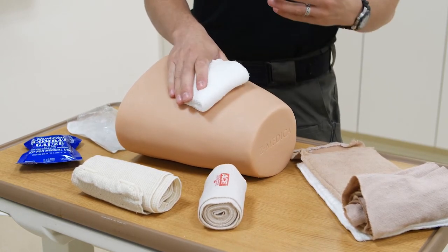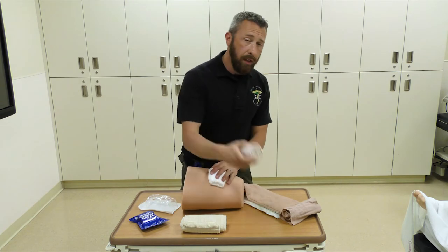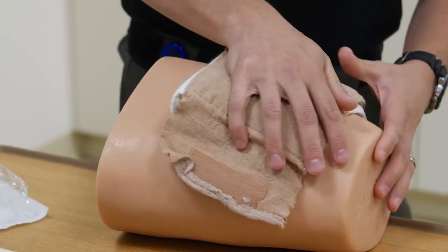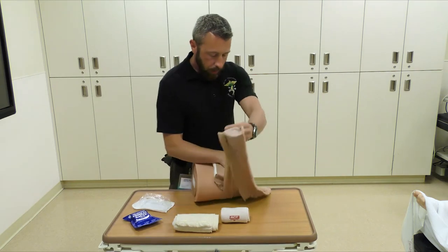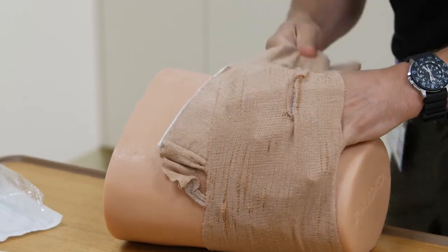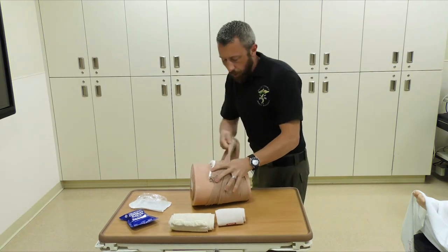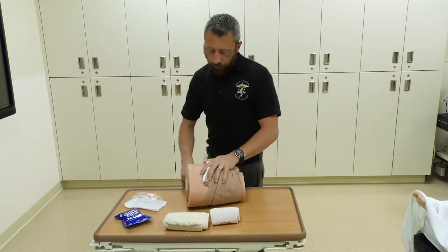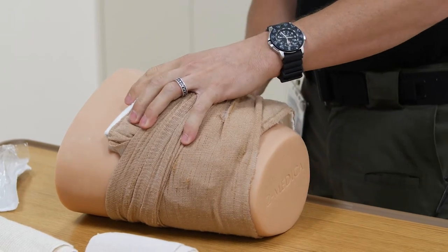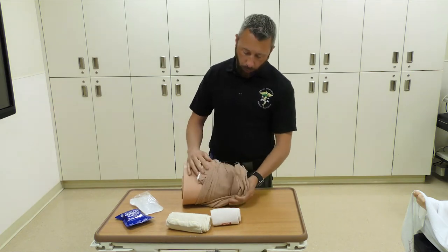We need something to maintain that pressure, so use either an emergency trauma dressing — basically an ACE bandage with a pad sewn on — or just an ACE bandage. Once the pressure dressing is in place, if you have two people, one holds pressure on top while the other wraps around the person. The first time around, pull it straight over with a little tension. The second time, throw a twist into it to tension down and force the product into the wound channel. Keep doing that, throwing a twist each wrap, and at the end tie it off or tape it to hold it in place.